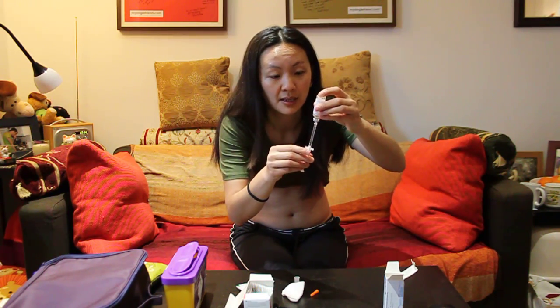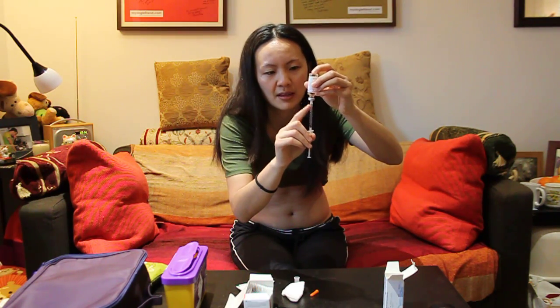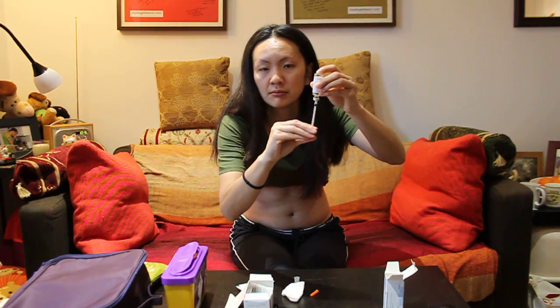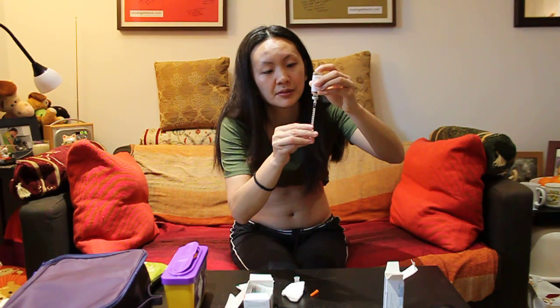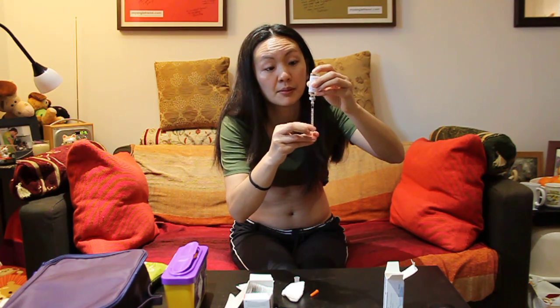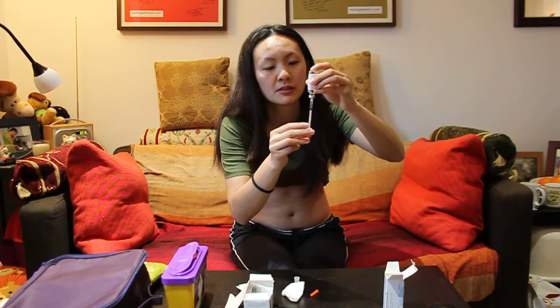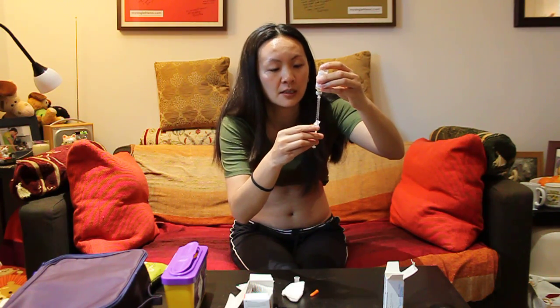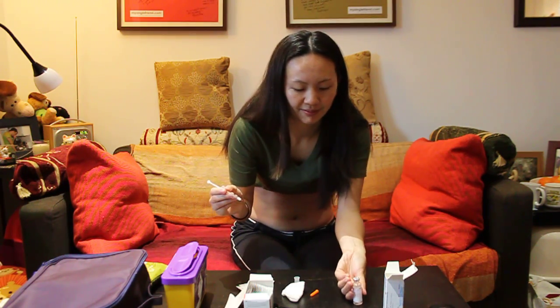Turn the vial upside down and start drawing your medicine out. Normally I get an air bubble, but if it happens, not to worry — just tap and push to squeeze the air bubble out, then repeat the process and pull. Hopefully you don't get any air bubbles — and then pull it down to 50 units, double check you've got 50, slight readjustment, tap tap tap, and then pull your needle out. Easy as that.